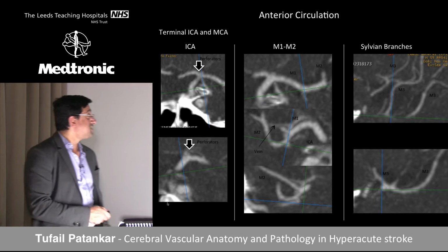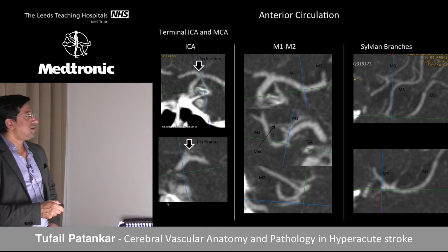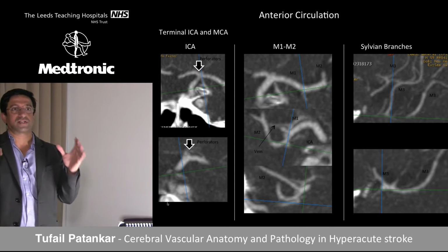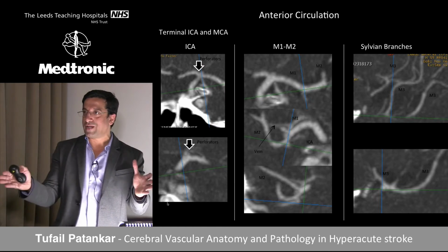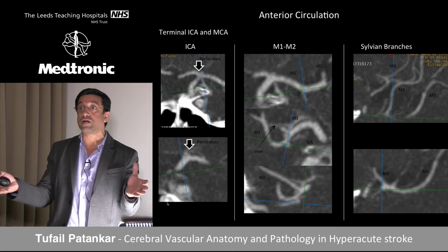So it's easy. Look at the internal carotid artery, anterior cerebral artery, middle cerebral artery, internal carotid artery. You need to learn to reconstruct these on your workstations, wherever you go, Siemens or Philips, and if your people don't train you, call me. I will come and train you on your workstations. It's easy. That's what Tommy Anderson did.